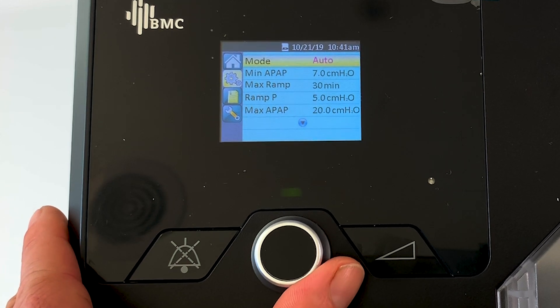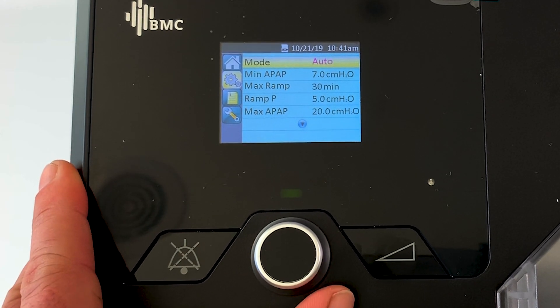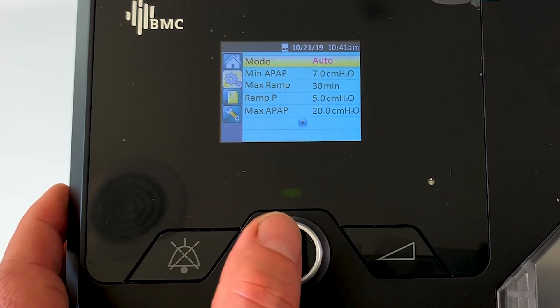Currently the mode is set to auto. If we click the button and highlight it, we can rotate the knob and change it to fixed pressure or CPAP mode. But 99% of you are going to want it in automatic mode, as you bought yourself an auto machine to begin with.